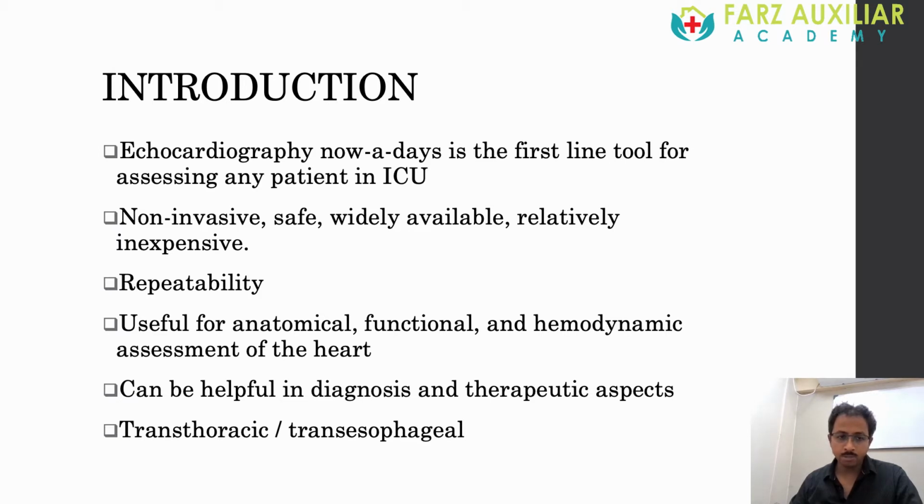There are mainly two types, transthoracic and transesophageal echocardiography. Mostly we as intensivists use transthoracic, and transesophageal echocardiography was usually done by the cardiac anesthesiologist in the OR.